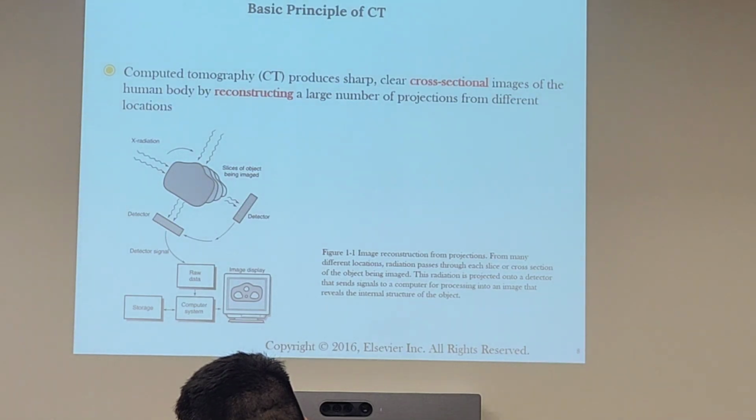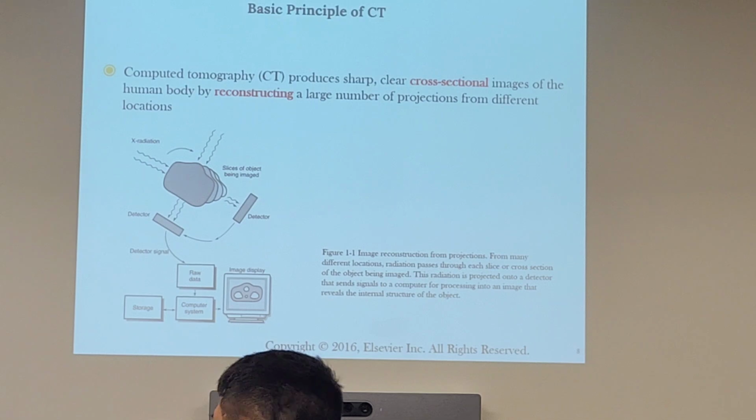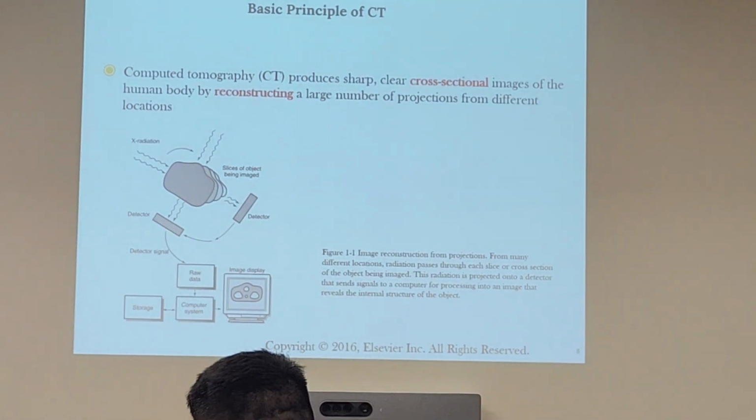Very good. All right. So then where do we get the image? How do I see it? How do I view if I aimed correctly? Did I go too much? Did I go too little? On the monitor. And that's the image display section. So as we continue to move through, we're going to take each and every section, go down to the bare bones, and go through each of those.